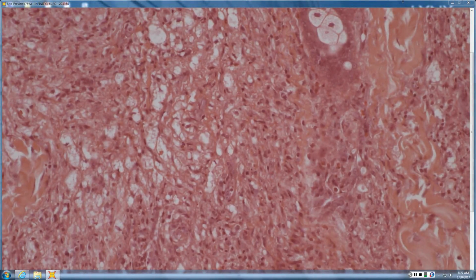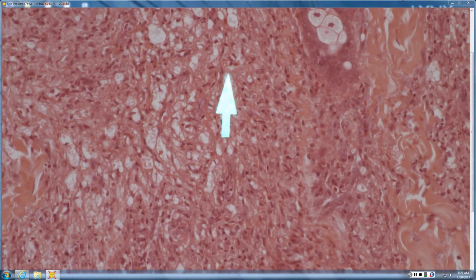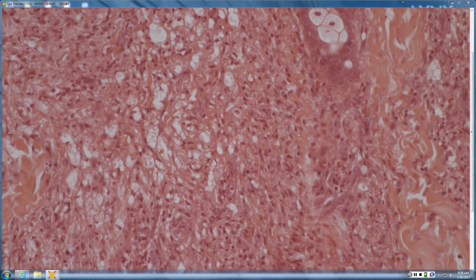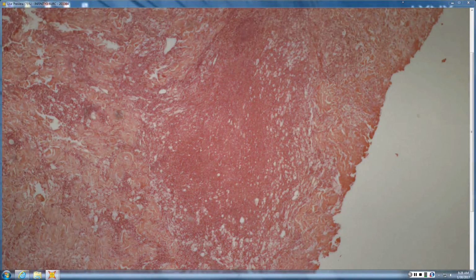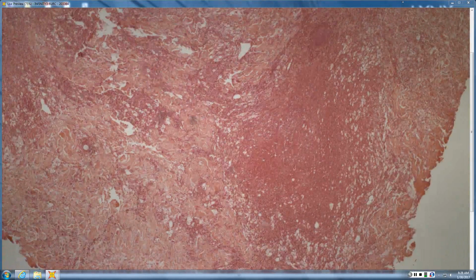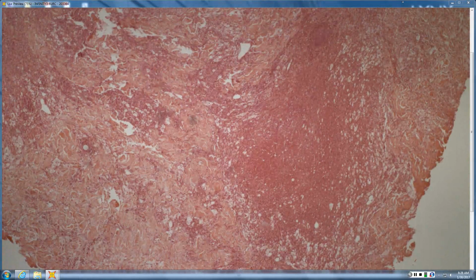So it's full of circles, and there's gray stuff in the circles, kind of clumpy, long, skinny things that clump. Right. So that's like the one. Looks kind of like lepromatous leprosy with globi, but what's with all the neutrophils here? Anything that's going to give you a neutrophilic reaction and vasculitis in someone who has globi? Like if they're a pregnant patient. What do they develop when they have leprosy and get pregnant? Painful areas on the back of their calf, which we call erythema nodosum leprosum. Very good.